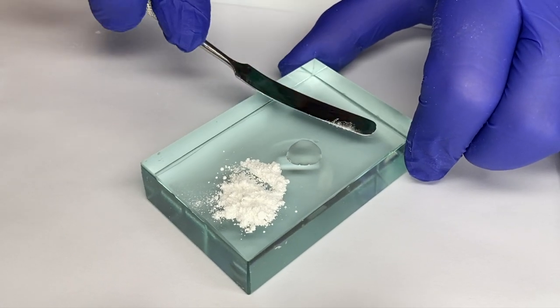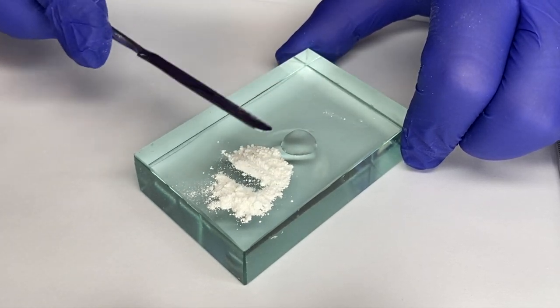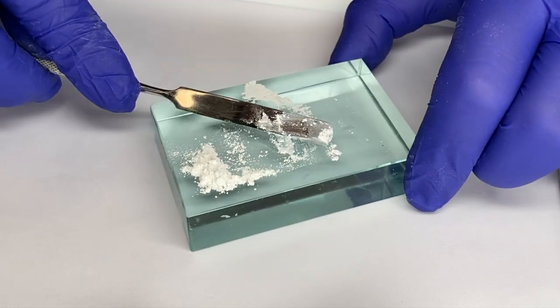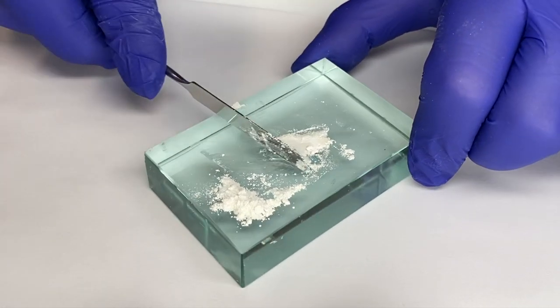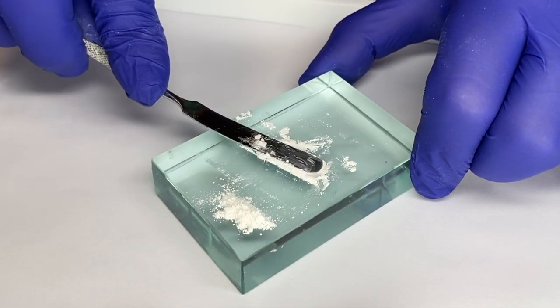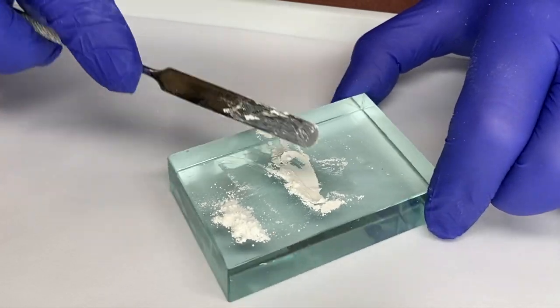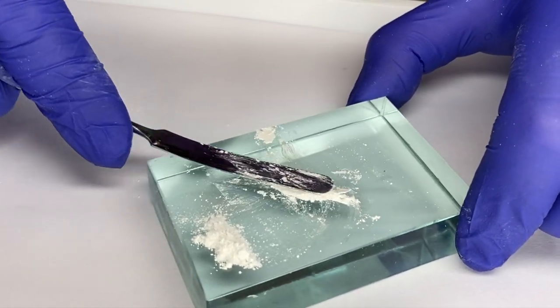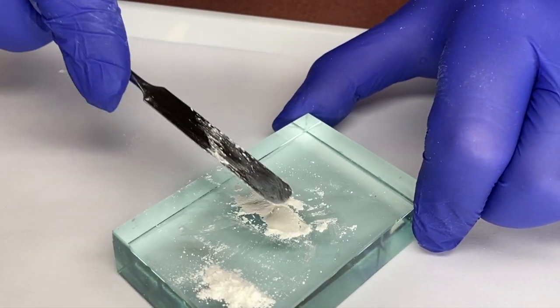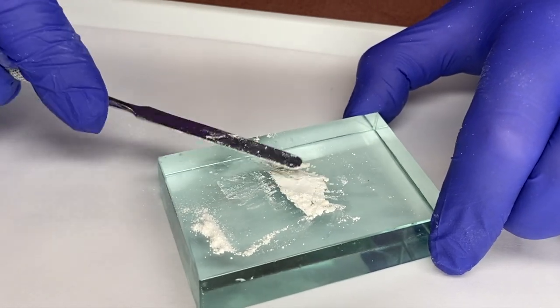And as I'm doing that, I'm going to see how I'm bending the spatula. I'm going to try to incorporate the powder into the liquid and make sure the liquid gets mixed in. That's how the material works. I don't know if you heard that on the alginate material, they say spatulate. We're going to do the same thing again. Mix this in here, see how it's starting to change from the powder and get a little harder. I've got to bring in a little more because we want to be able to roll this into a ball.